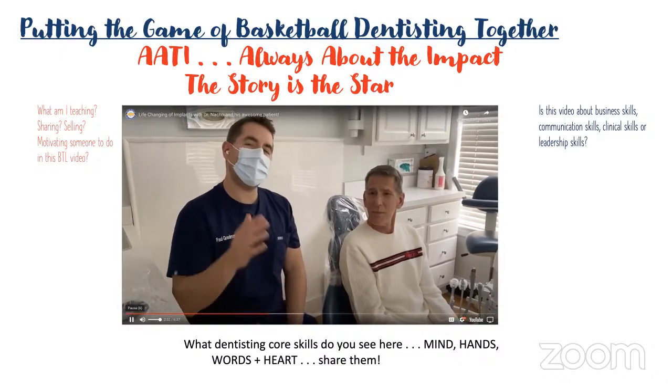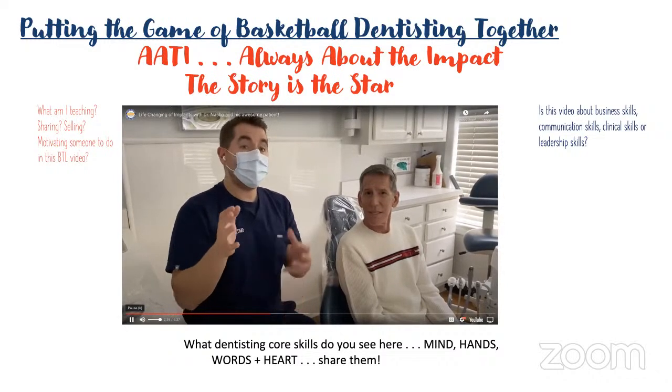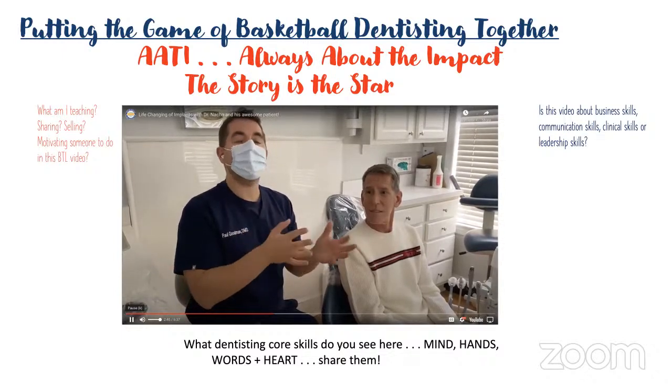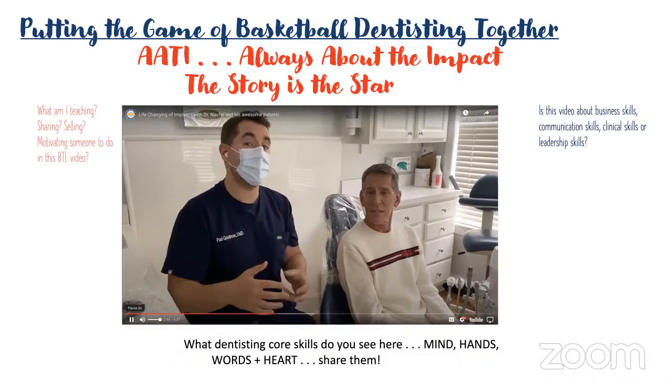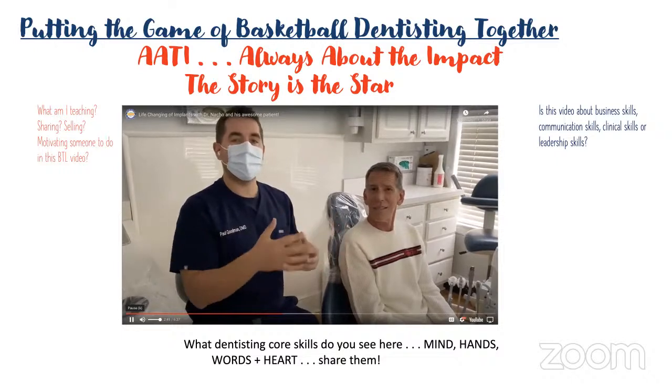Now, a couple things. So I know my dental people. We're an interesting people. Dental school teaches us to be an interesting way. So we've replaced regular natural teeth with implant-supported teeth, traditionally called fixed hybrids. We did this in 2012. So we use different materials now, but we have acrylic over a bar, which has been great.